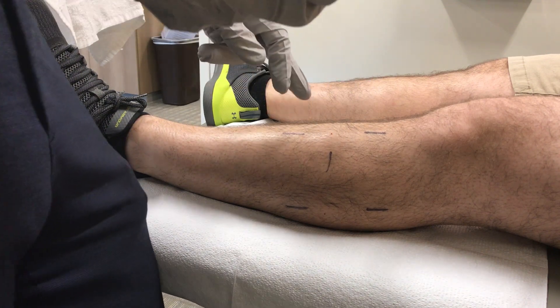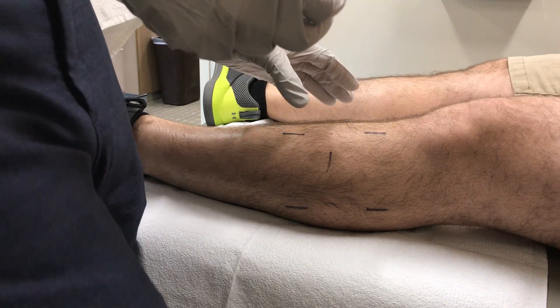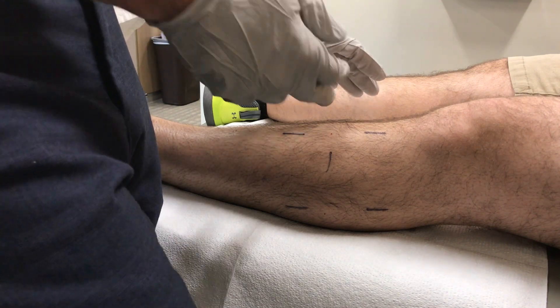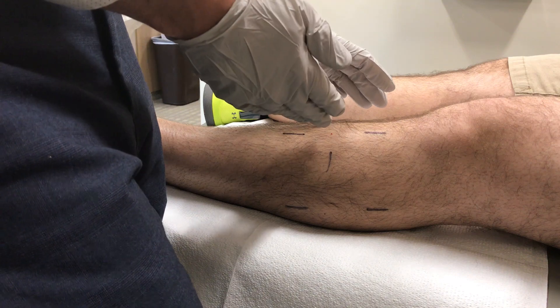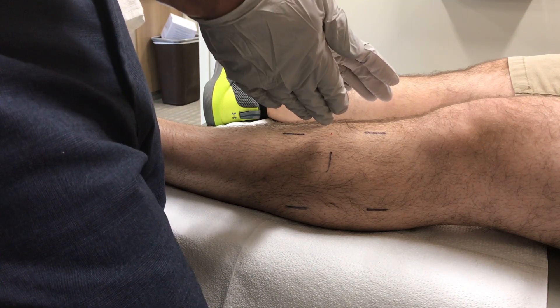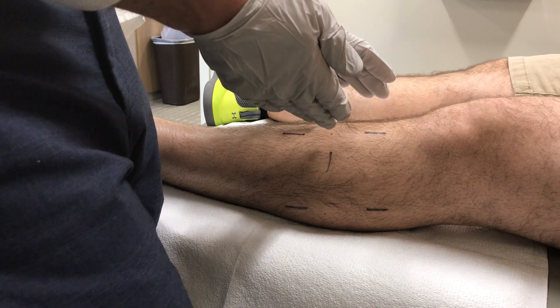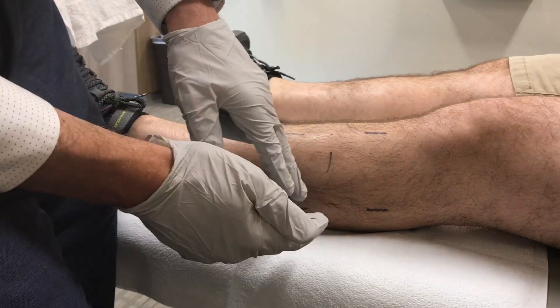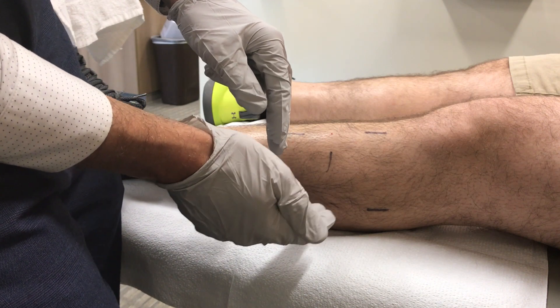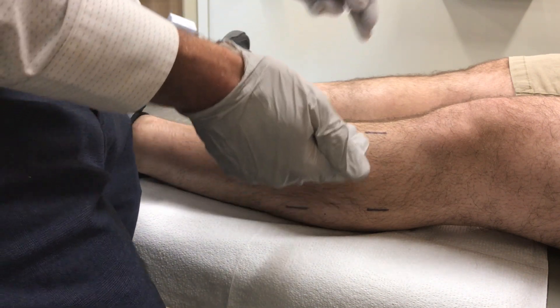For the anterior compartment, right around that line you palpate the tibia and go just to the lateral border of the tibia, directed perpendicular to the skin. For the lateral compartment, you go just anterior to the posterior aspect of the fibula to access the lateral compartment.